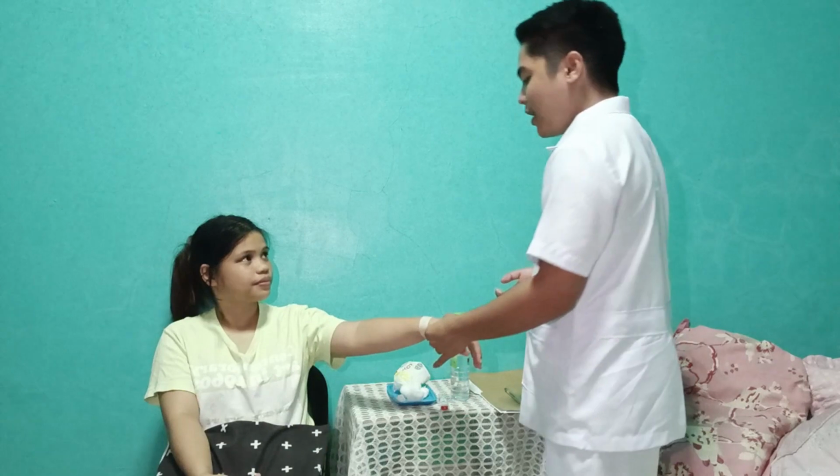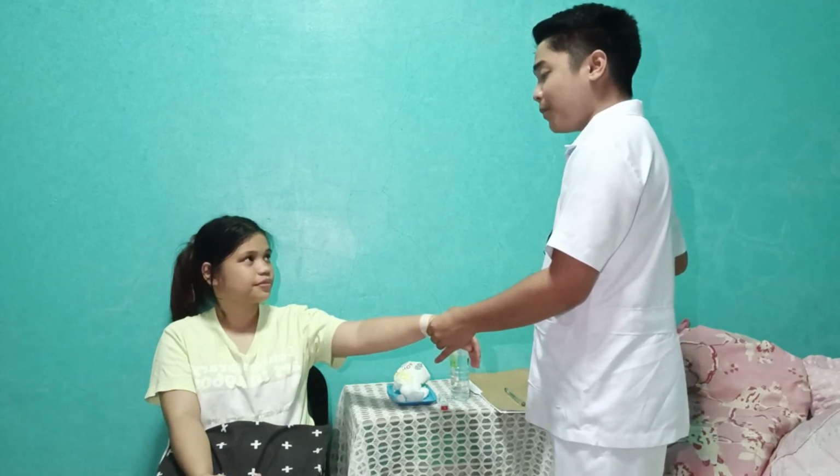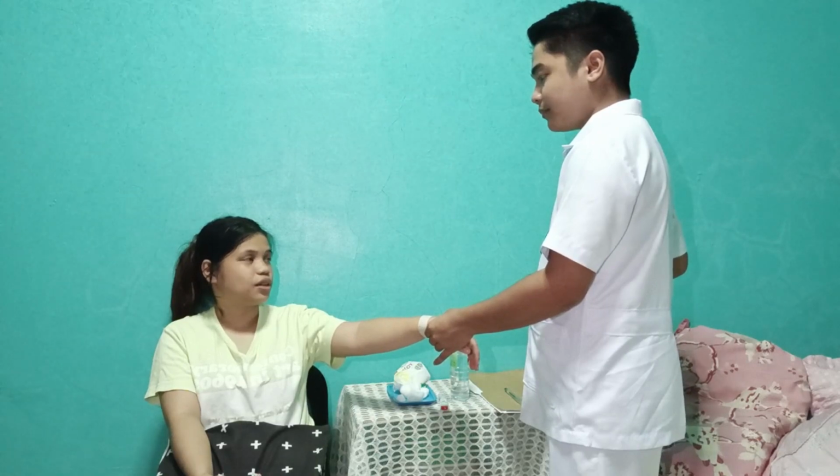Yes. Okay ma'am, so may I see your hands please? Ma'am, what is your name? Aya Alba. Okay, Ma'am Aya. What is your birthday, ma'am? November 16, 2003. Okay, thank you, ma'am. So, ma'am, I'm going to pull up your sleeves to put the thermometer under your armpits.